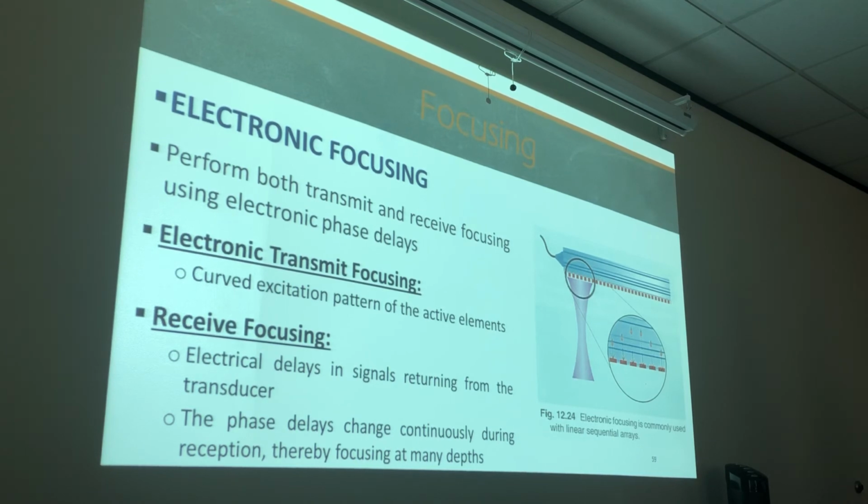Okay? Receive focusing is done with electrical delays in the signals returning from the transducer. Returning from the transducer because it's already created to make the sound waves into electricity, right? So the phase delays change continuously during reception, thereby focusing at many depths, thereby improving lateral resolution during reception. Okay. We already covered this when we talked about dynamic receive.